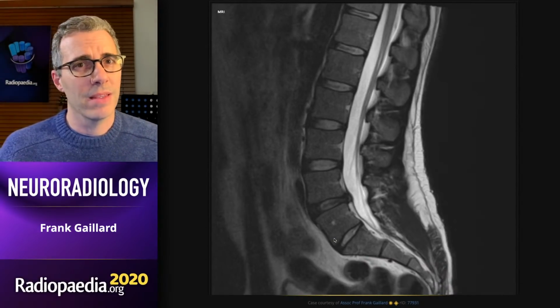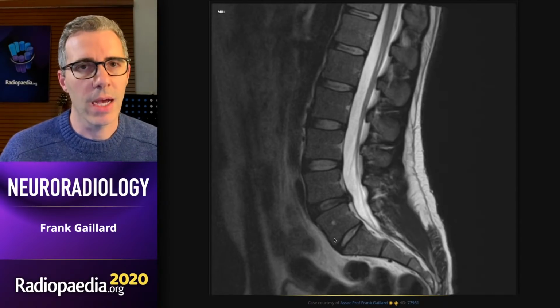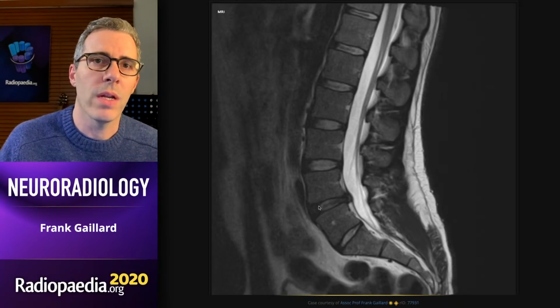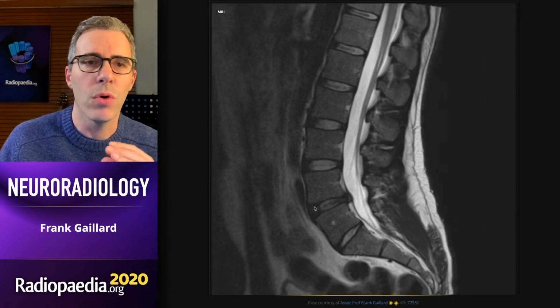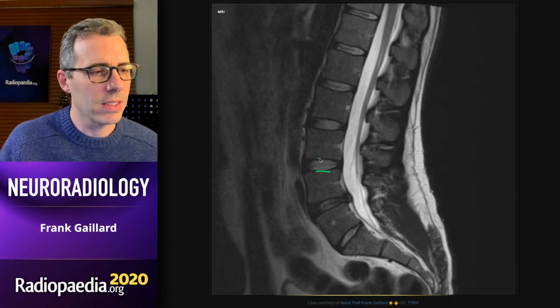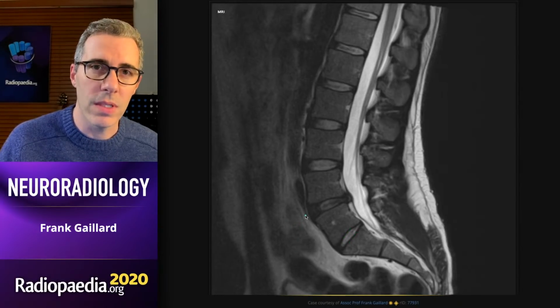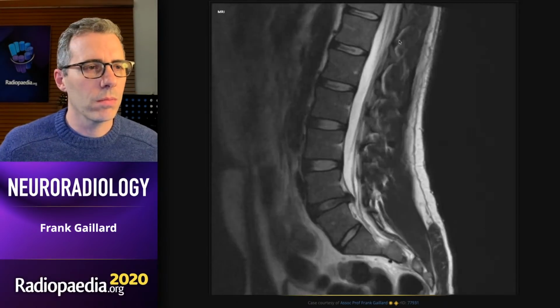So let's first talk about the simple things that you'll always have just on the lumbar spine MR, no matter how targeted the study is. The first thing is that the L5S1 disc is wedge-shaped, whereas most of the other discs are more horizontal. So if we have a look at this disc, this already has a bit of a wedge in appearance compared to, say, this one or the one below it that are more horizontal. So that, at first glance, would make you think that this was the L5S1 disc. Well, let's look at the conus.